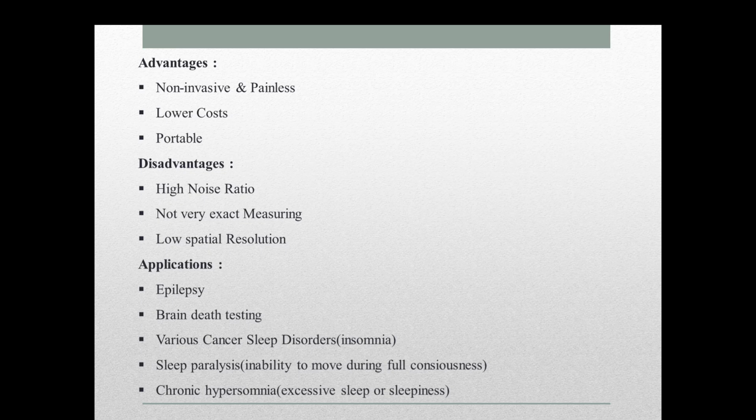And the applications are epilepsy, brain death testing, and various sleep disorders, for example insomnia. And it can detect sleep paralysis, right? It means inability to move during full consciousness. Next, it is used to detect chronic hypersomnia, that is either excessive sleep or sleepiness.